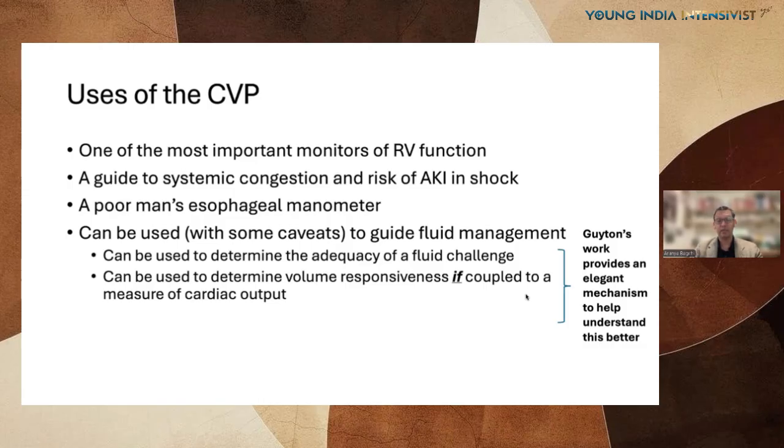But why it doesn't is not because the CVP is useless. It's because we are not asking the right question. And all the papers in the world, and there are literally dozens, if not more than 50, that say we should stop using invasive pressures because they're useless, they're completely unhelpful, they don't improve outcomes, I think these are all very, very misguided.